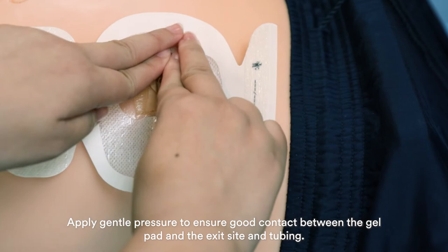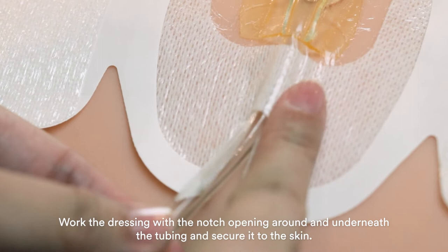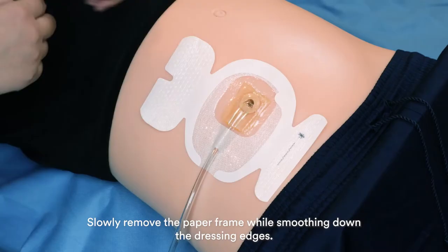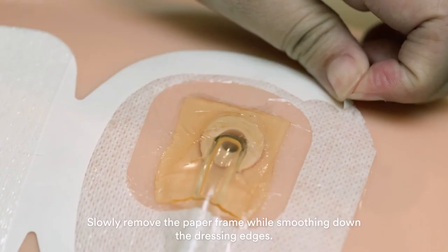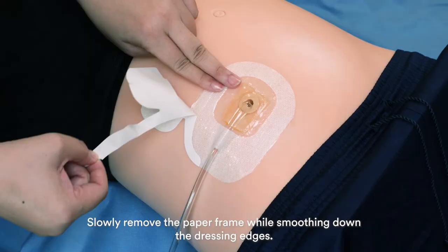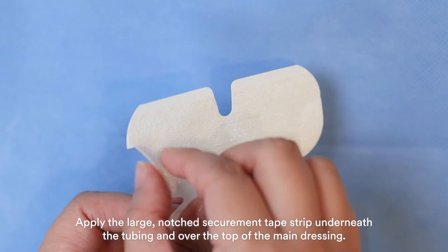Apply gentle pressure to ensure good contact between the gel pad and the exit site and tubing. Apply gentle pressure to the rest of the dressing. Work the dressing with the notch opening around and underneath the tubing and secure it to the skin. Make sure to remove the paper frame — slowly remove the paper frame while smoothing down the dressing edges.